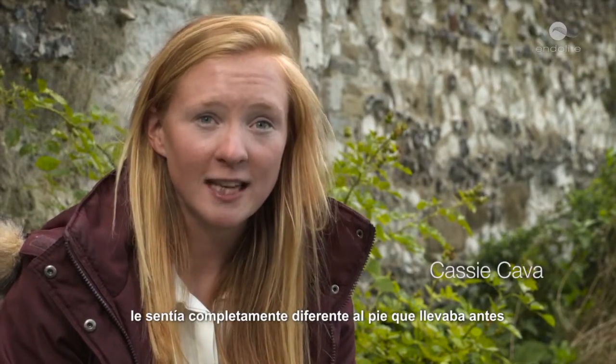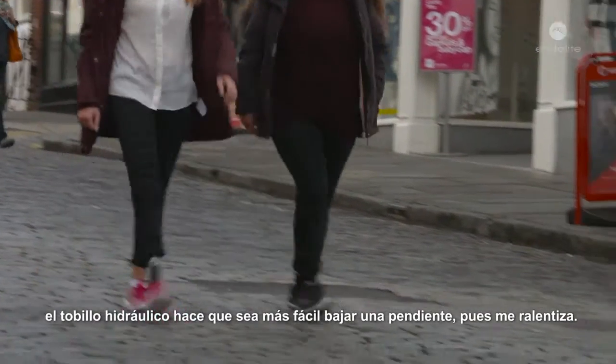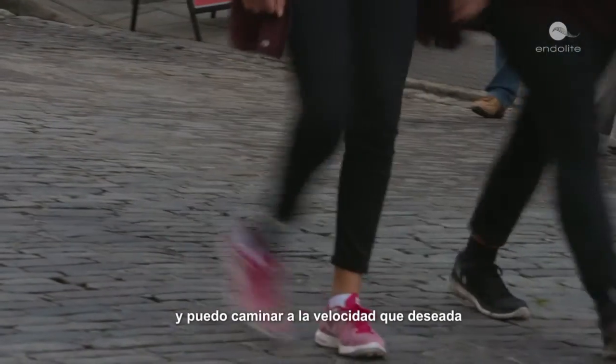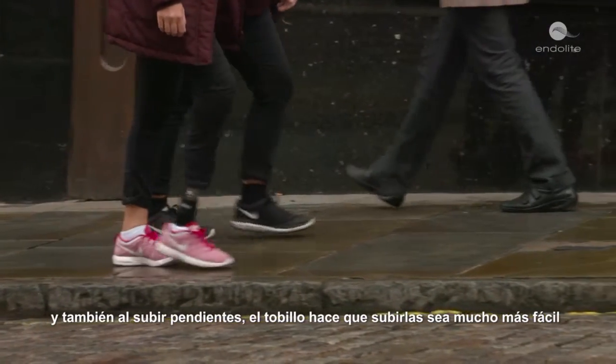When I first started wearing the Elan, it felt completely different to the foot I had before. I suddenly had a lot more movement. The hydraulic ankle makes it a lot easier. With going downhill, it slows me down — it helps with my braking so I'm not losing control. And going uphill as well, the ankle makes walking uphill a lot easier.